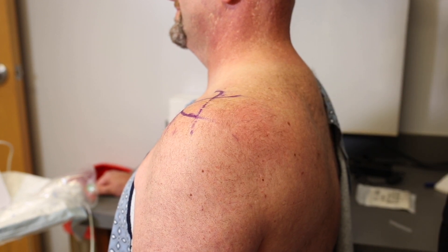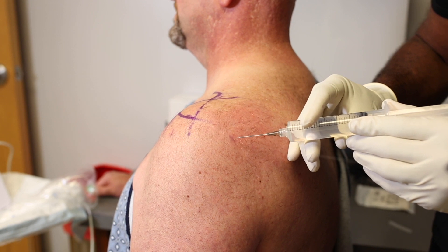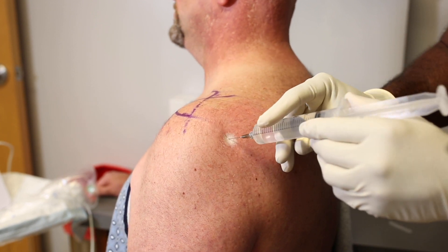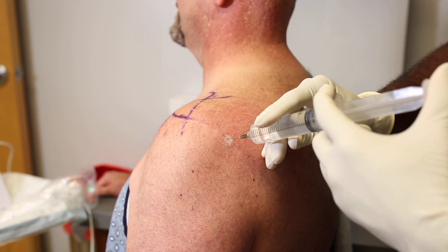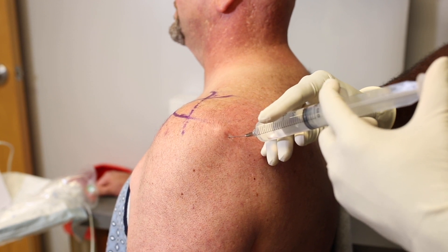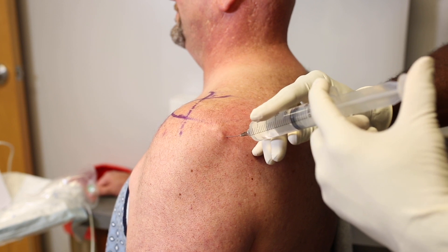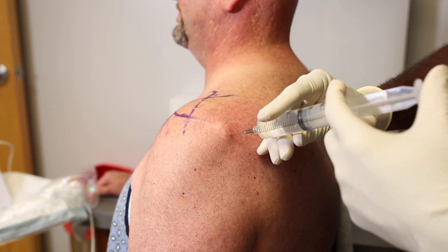After drawing the bony anatomy, we can identify the posterior portal by centralizing the glenohumeral joint with the ultrasound transducer. Once we have that entry portal localized, we can spray some ethyl chloride and inject a little bit of lidocaine at the portal site. Then we wait approximately five or six minutes to let the lidocaine set up so that the rest of the procedure is minimally uncomfortable for the patient.